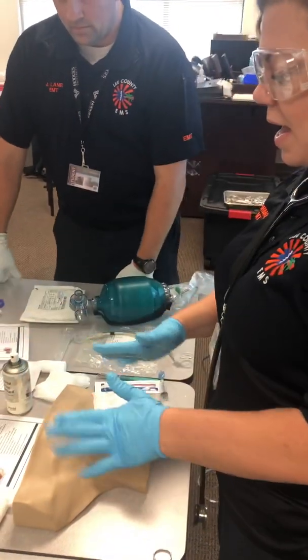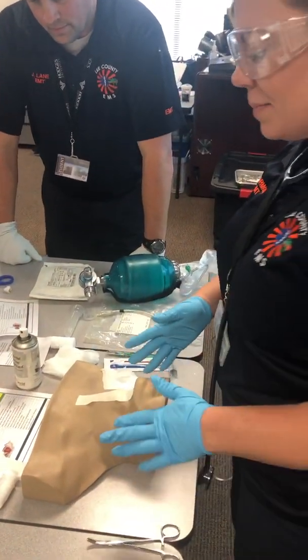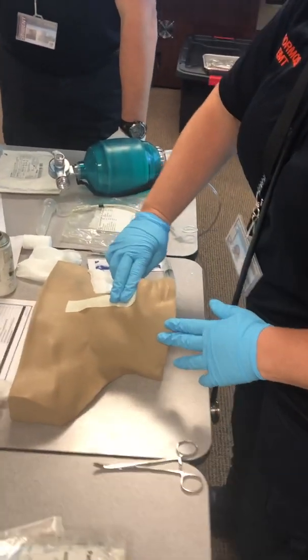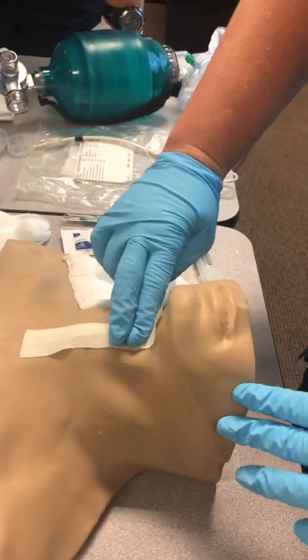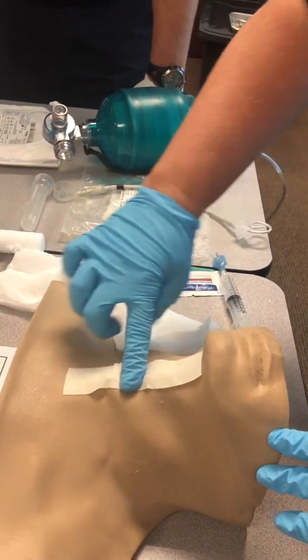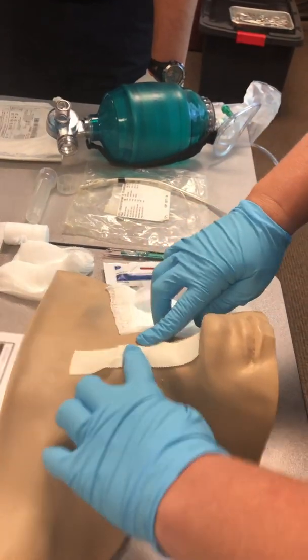First, make sure that the patient is supine, head and neck in midline and in neutral position. Then identify the cricothyroid membrane — here's a peak, a valley, and then a peak. You want to go in between the two peaks, which is the landmark.